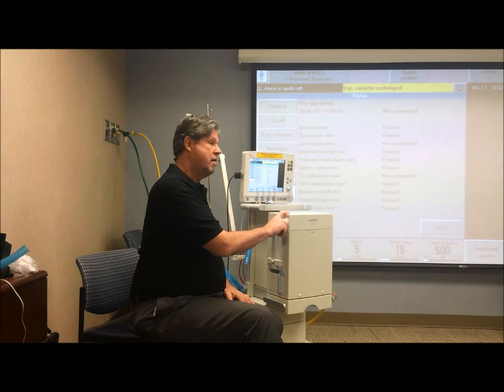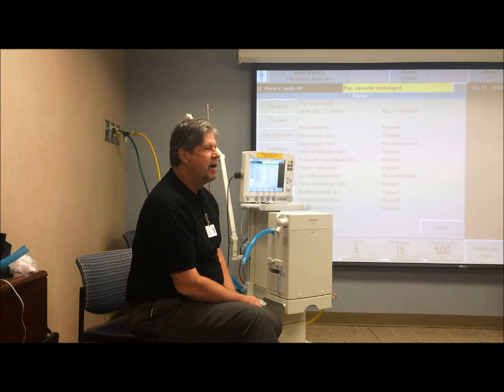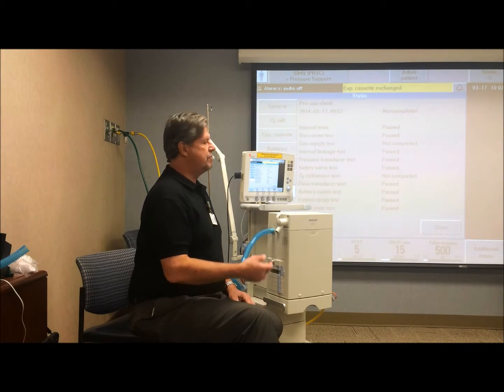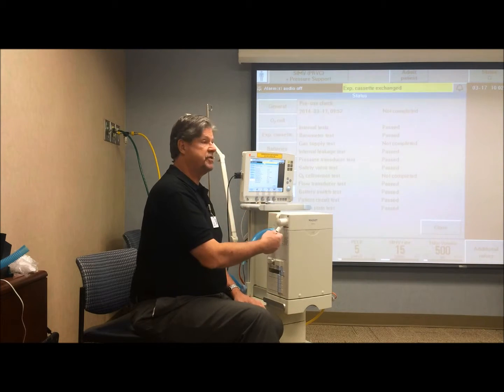Sometimes, for example, I get called quite a few times for people where the ventilator no longer holds PEEP. Like for example, if the PEEP is set at 14, it only will be reading 7. We change out the cassette, and when you tip it, it'll have some water in it. So then the new cassette, it's set at 14, reads 14.